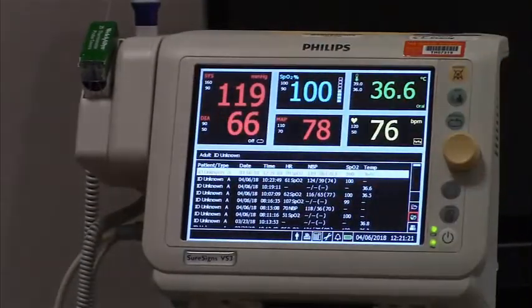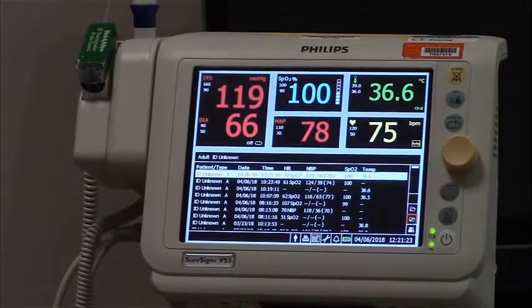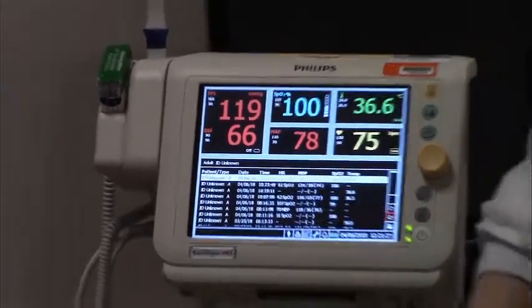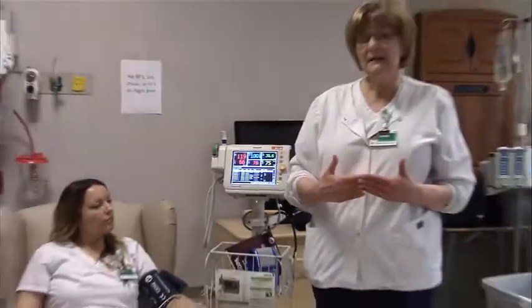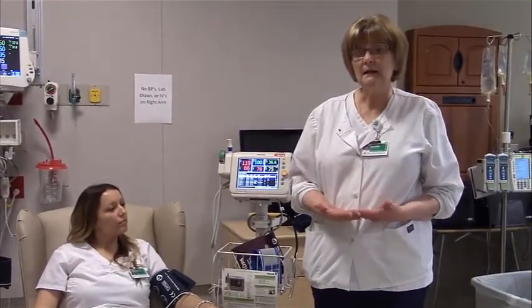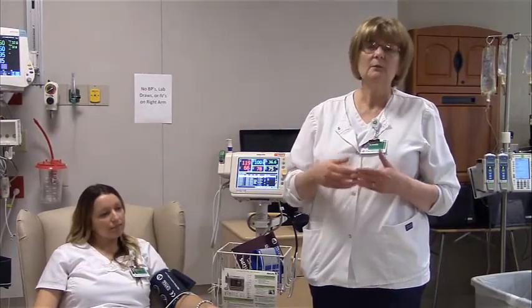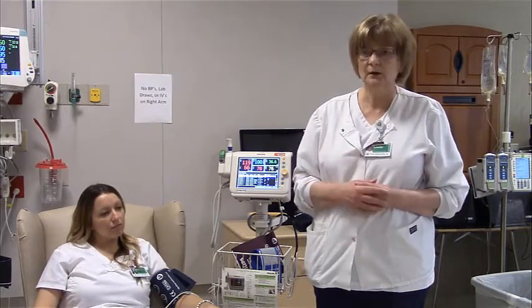Now we have everything but that one piece, respirations. That's where you have to remember to do that. All right, so this is where we're going to end here. Again, you're going to have practice in the live class. If you need to review this, you can always review it, but I want you to make sure that you come at least aware of what we're going to do.